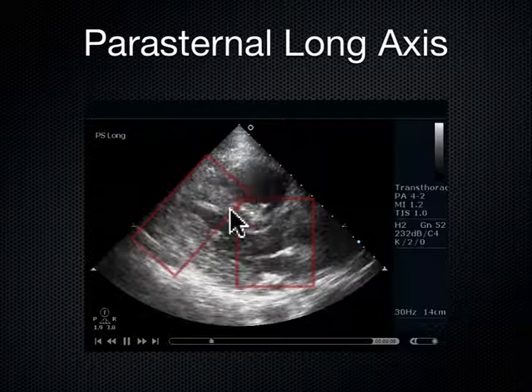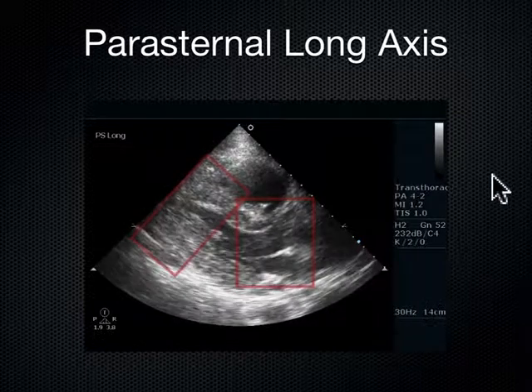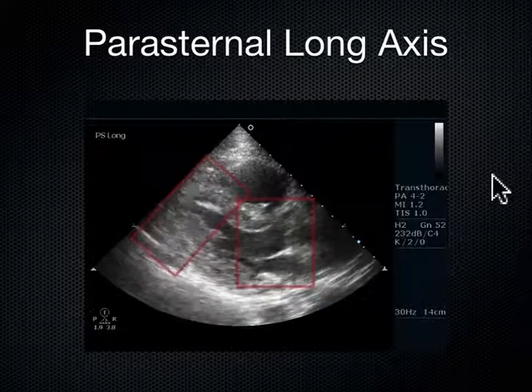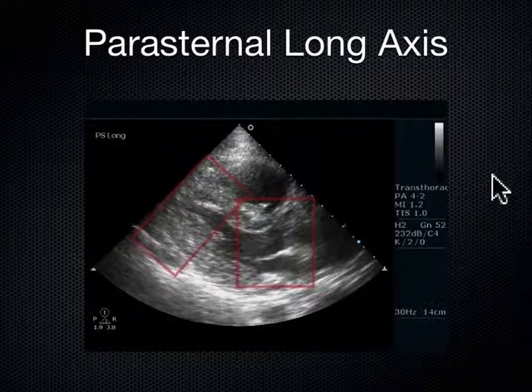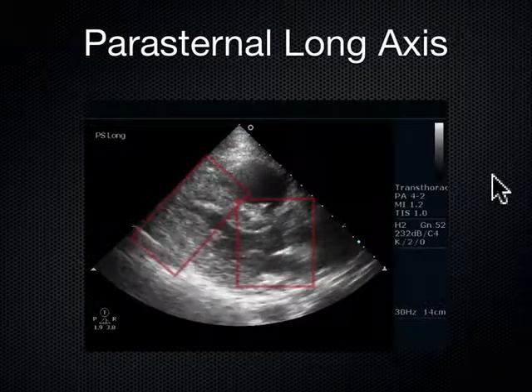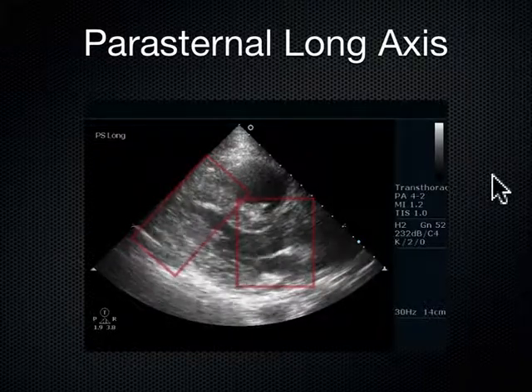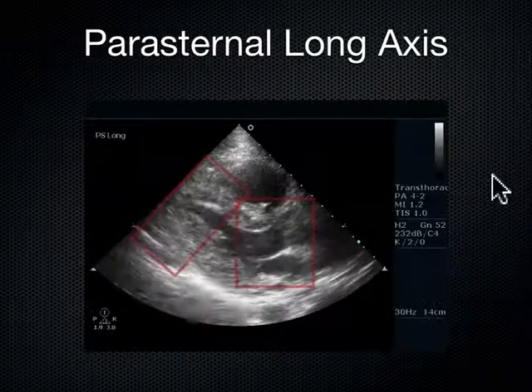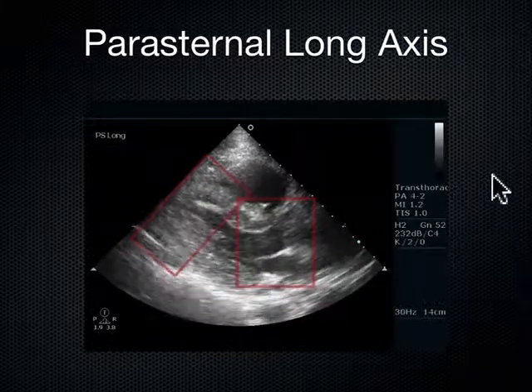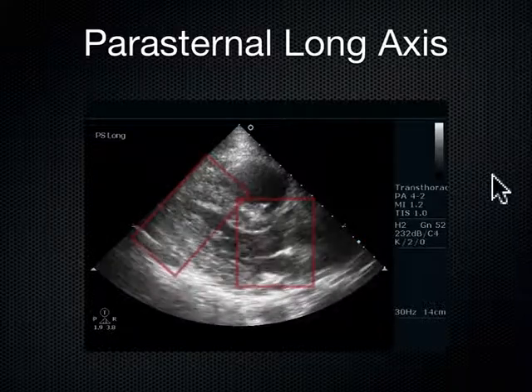It's actually larger than the left ventricle, and in certain settings, this is a problem because when we see somebody with a large right ventricle, normally the right ventricle is only 2/3 the size of the left ventricle. When someone gets a right ventricle that gets as big or even bigger, like this case, than the left ventricle, that's a sign of right ventricular strain.